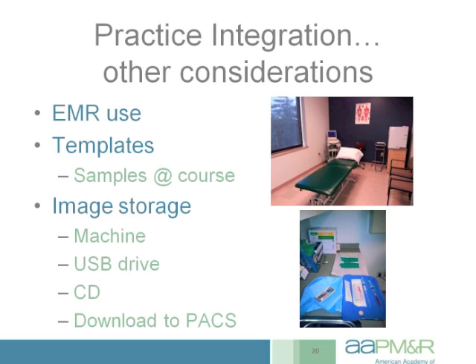that in the back of the machine about once a week, download the last week's procedures, and then load those directly into our EMR. That way, if I'm seeing a patient back and perhaps they got an unexpected response, or we just wanted to show them the pictures from their procedure, we can bring up the images and review them right there while we're sitting with them in the room.